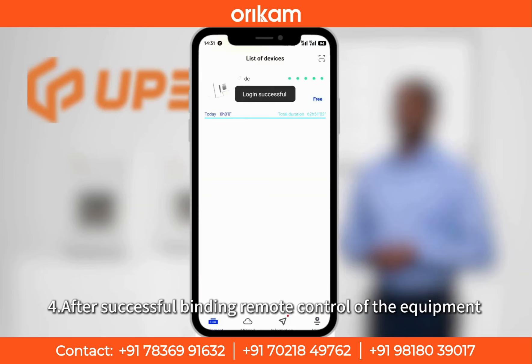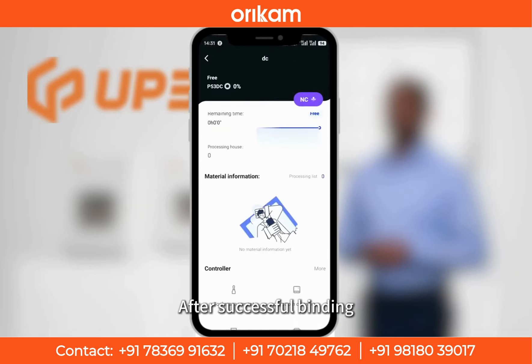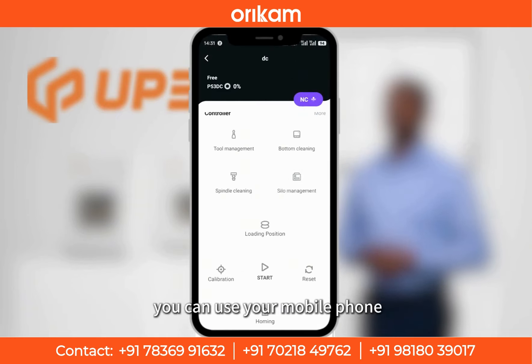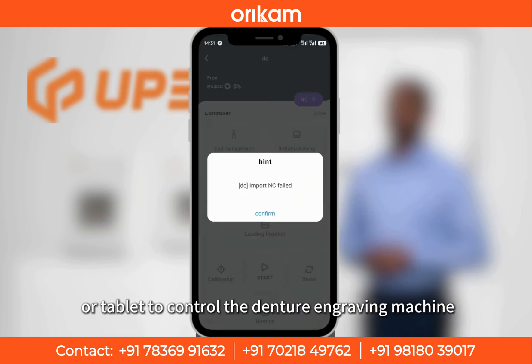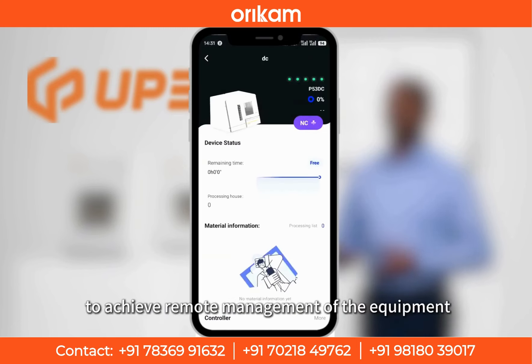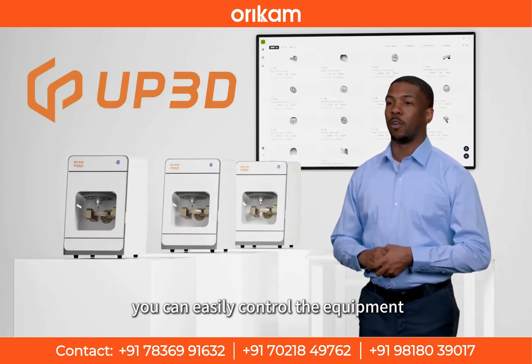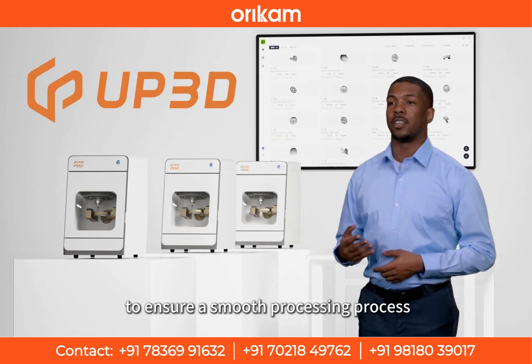Step 4: After successful binding, remote control of the equipment. After successful binding, you can use your mobile phone or tablet to control the denture engraving machine in real time, to achieve remote management of the equipment. Whether at home or outside, you can easily control the equipment to ensure a smooth processing process.